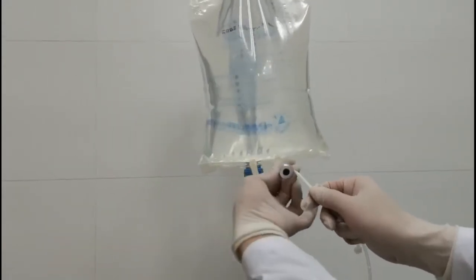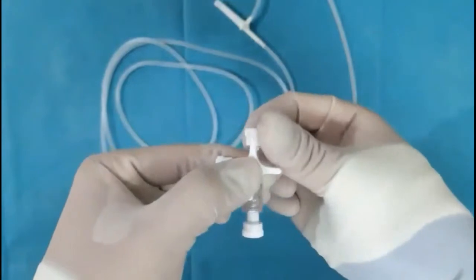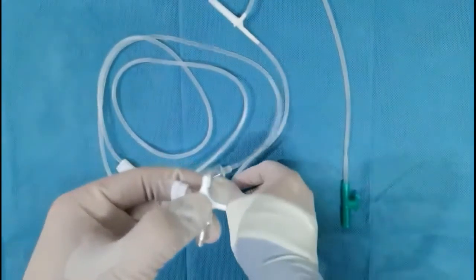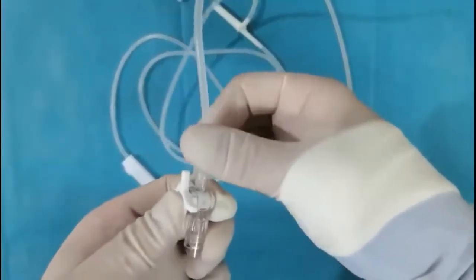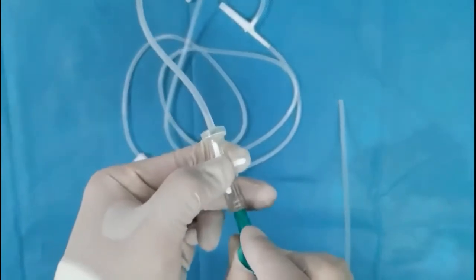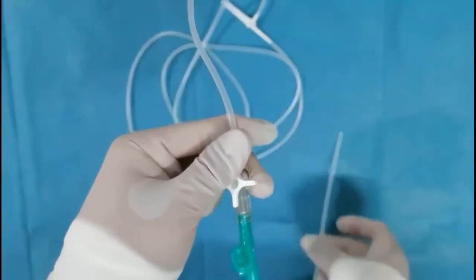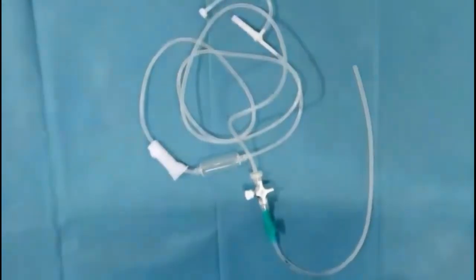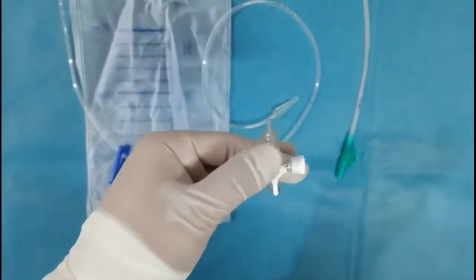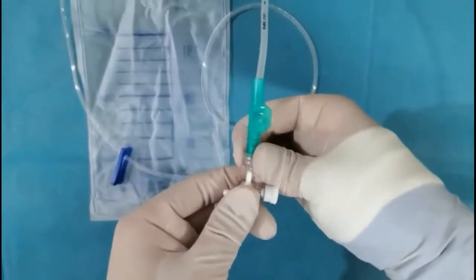The rubber mouth of the sodium chloride irrigation solution is punctured with the tip of the infusion set. The first three-way stopcock is then connected with the infusion set and inflow tube. The other three-way stopcock is connected with the outflow tube and urine drainage bag.